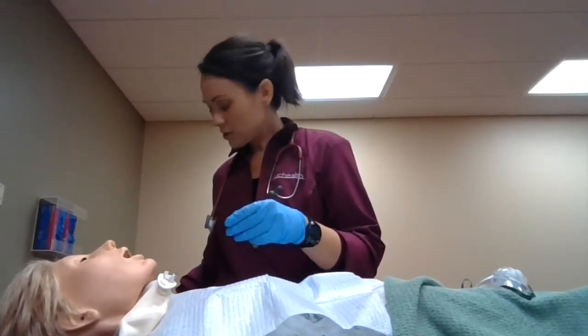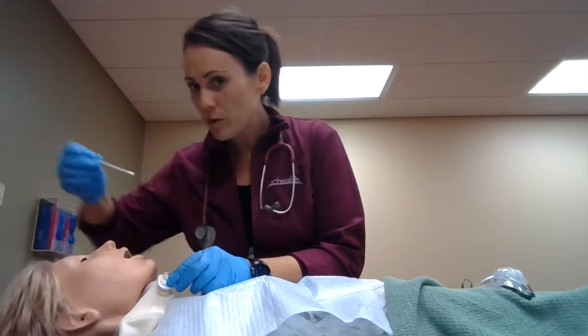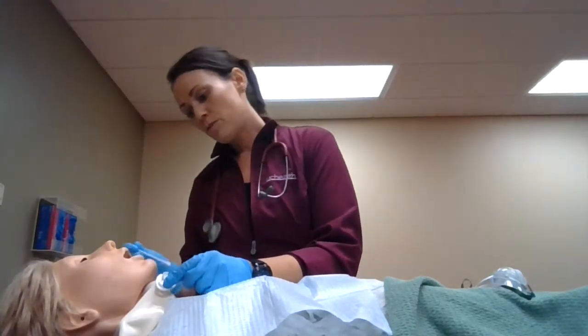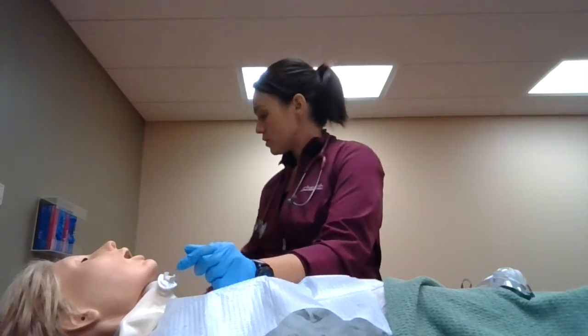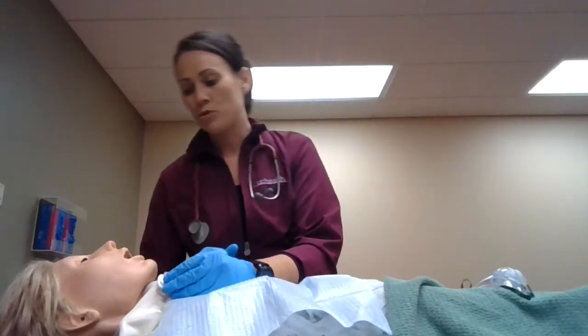I'll get our Q-tips and make sure that we're starting from the inner part and rotating outward while we're cleaning, tossing with each swipe — inner to outer, toss, hold to the other side, inner to outer, toss. We'll look and inspect the stoma site and make sure that there's no pus, irritation, discharge, or anything abnormal. We'll make sure to document and let the nurse know.